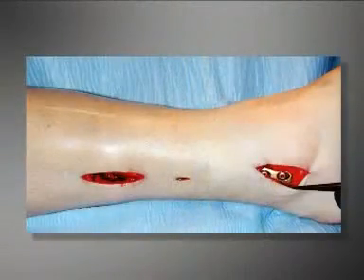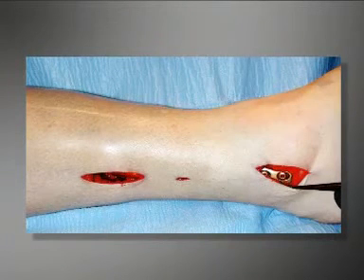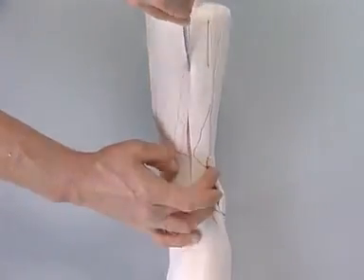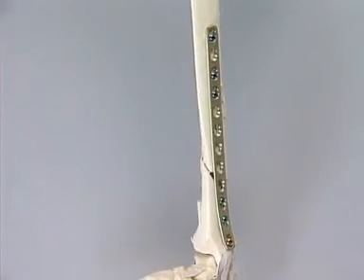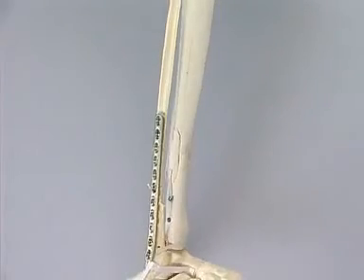This is the clinical appearance after completion of the percutaneous internal fixation of the fibula. To finish the exercise, the soft tissue mantle is opened up. This reveals an internal bridging fixation of this multifragmentary fracture of the lower leg, which is correct for length, axis, and rotation.